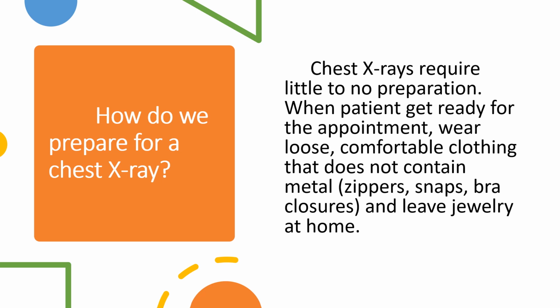So what we will propose for chest X-ray. Here also we will make the patient change into the hospital gown, and we will ask the patient to remove all the jewelry.